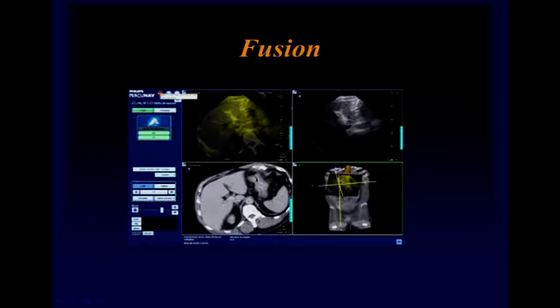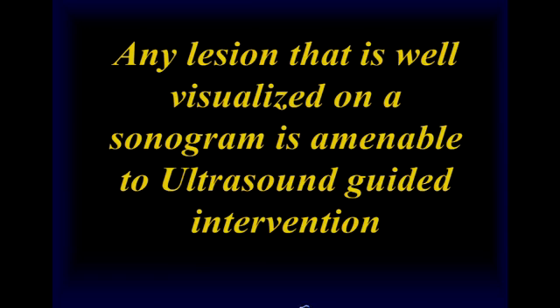Then, of course, we have fusion technology, where we can see the lesion on CT or MR, then go back to the ultrasound machine, because ultrasound has a big advantage of being real time, fuse the CT or MR pictures with the ultrasound pictures, and then do the procedure accurately.